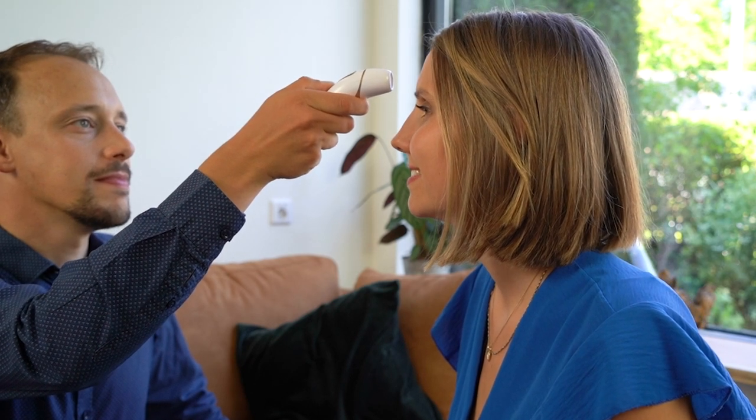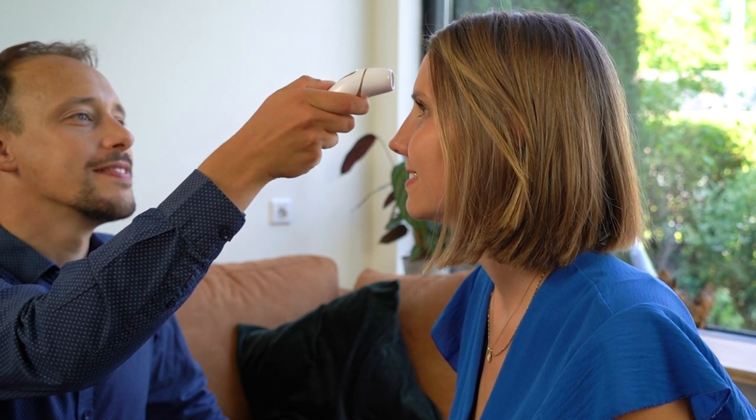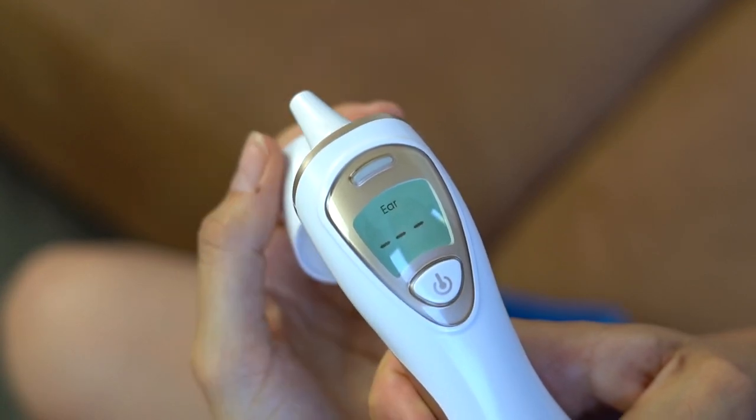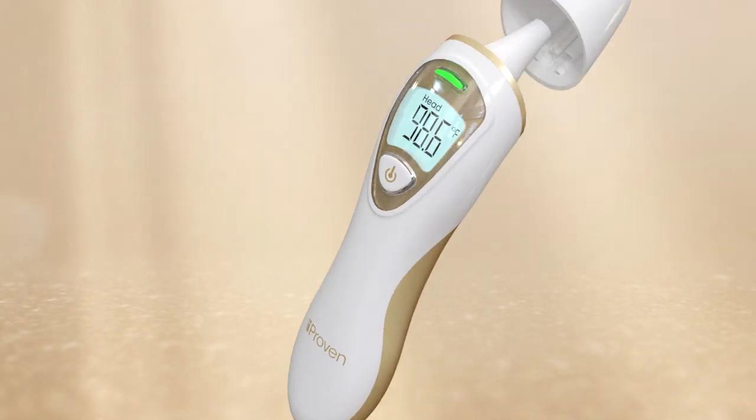Press the button. It takes a second to calibrate and another second to measure the forehead temperature. It will vibrate once it's ready. To easily switch to the ear mode, simply take off the magnetic sensor cap.